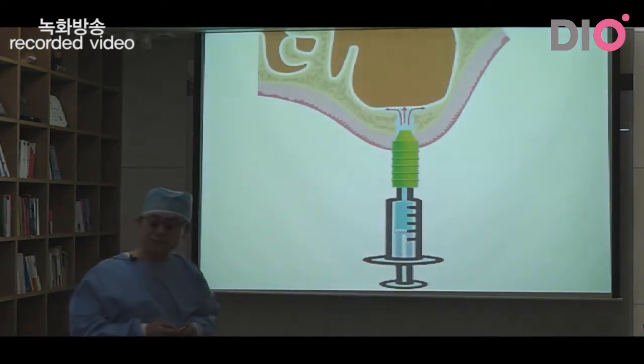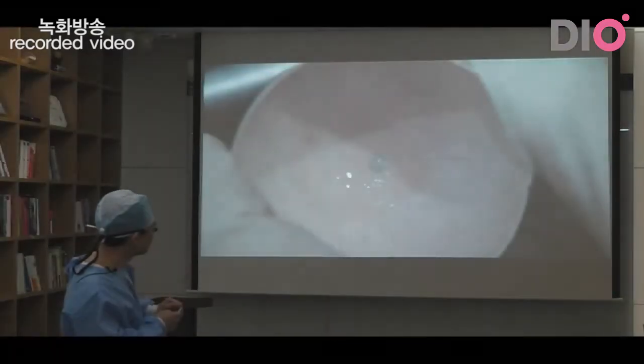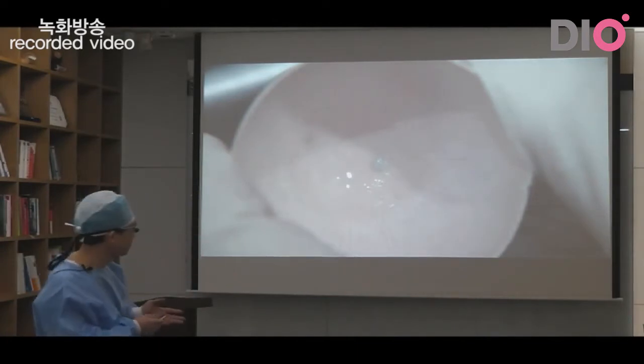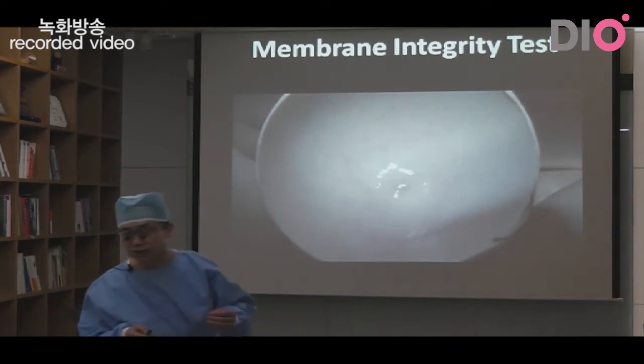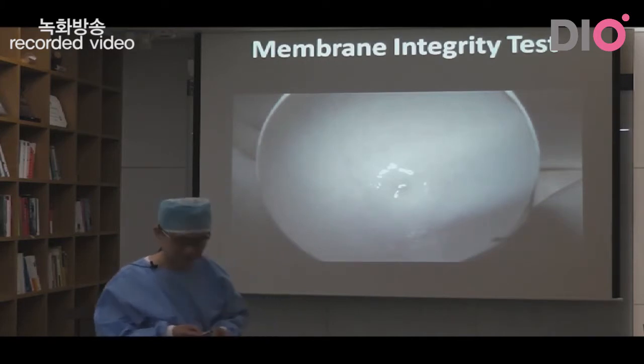To lift the sinus membrane, I will use saline injection. I inject the saline into the hole to lift the sinus membrane. You can see here the membrane will be lifted. To test the membrane integrity, I'm going to use aspiration technique. If you can pull out the liquid that you injected, it suggests that the membrane remains intact.